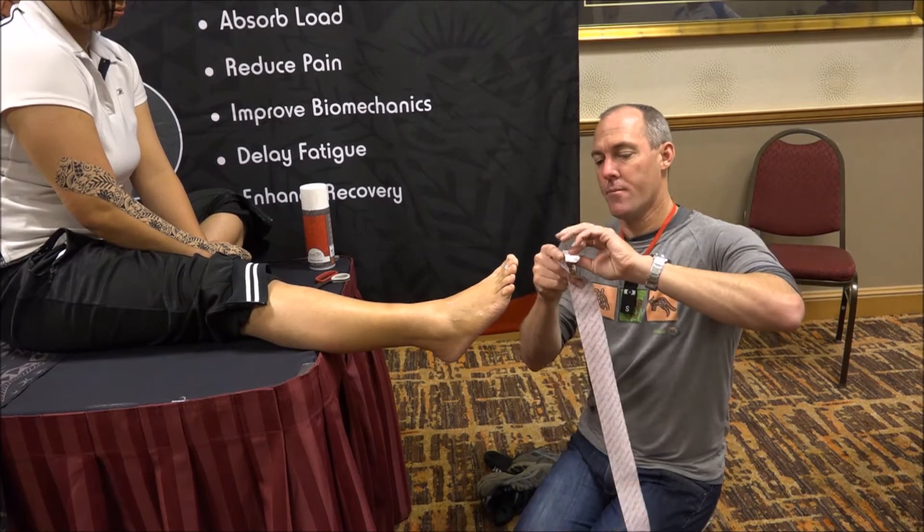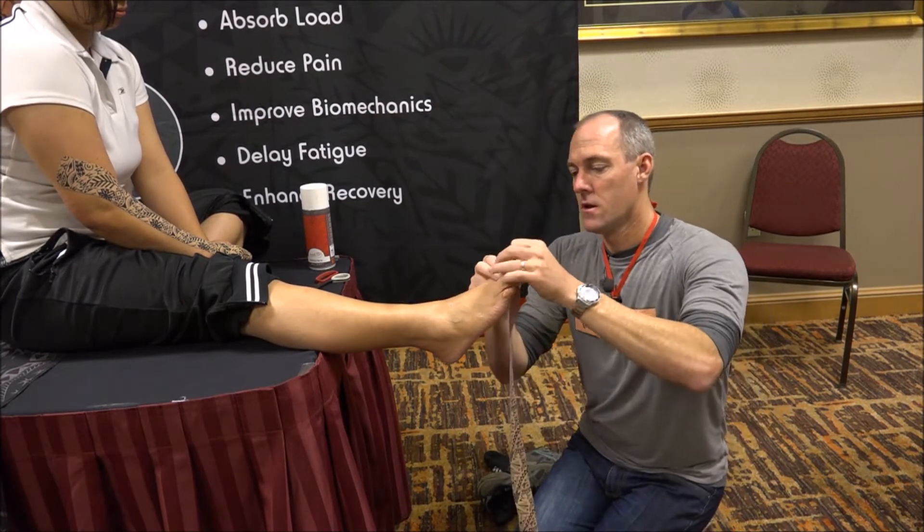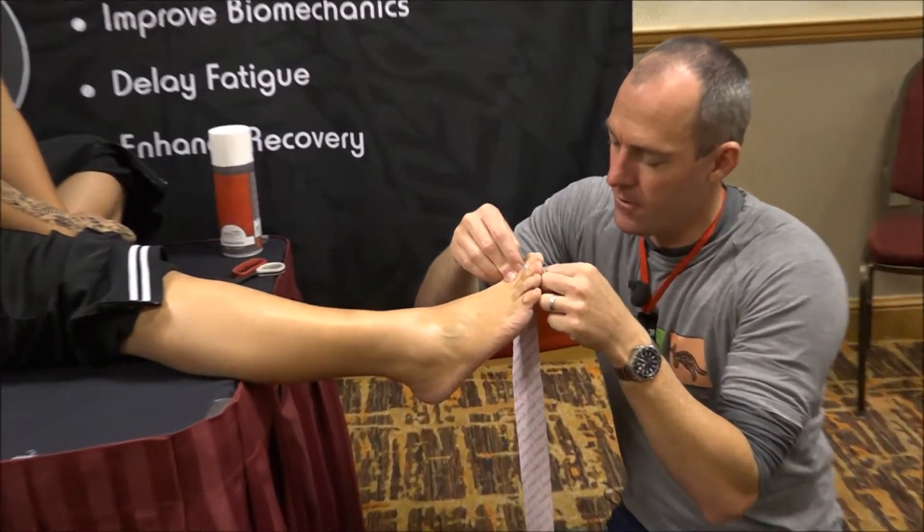Tear your backing paper so you don't have to touch the glue, then stick that on and just wrap that in around there. That just allows it to come in and anchor on there.